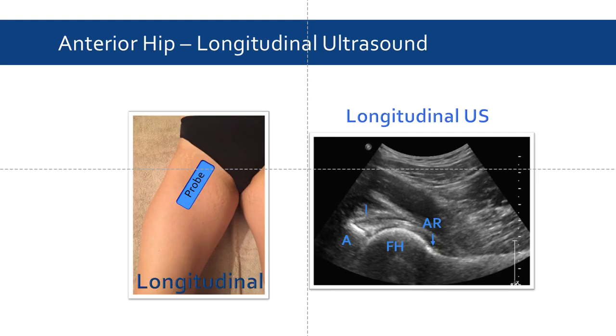Next, we can slide the probe medially and rotate the indicator towards the umbilicus. This gives us a longitudinal view of the anterior hip. Here we can see the femoral head and the acetabulum. And if we follow the femoral head, we can visualize the anterior recess, where fluid is likely to accumulate in a hip effusion.